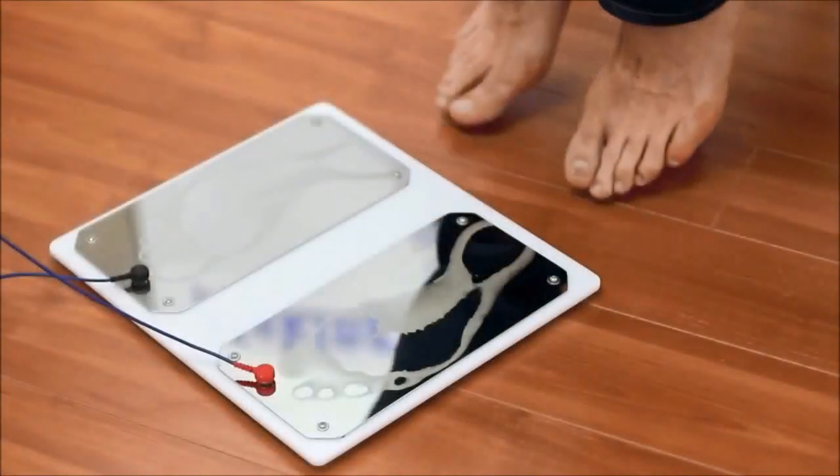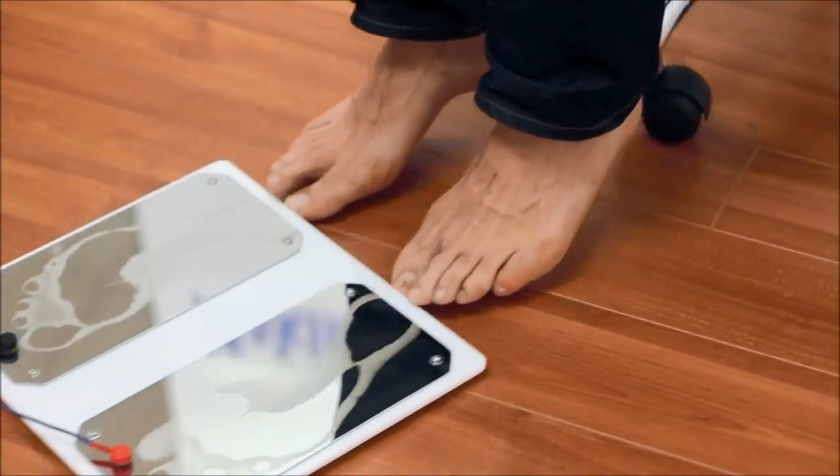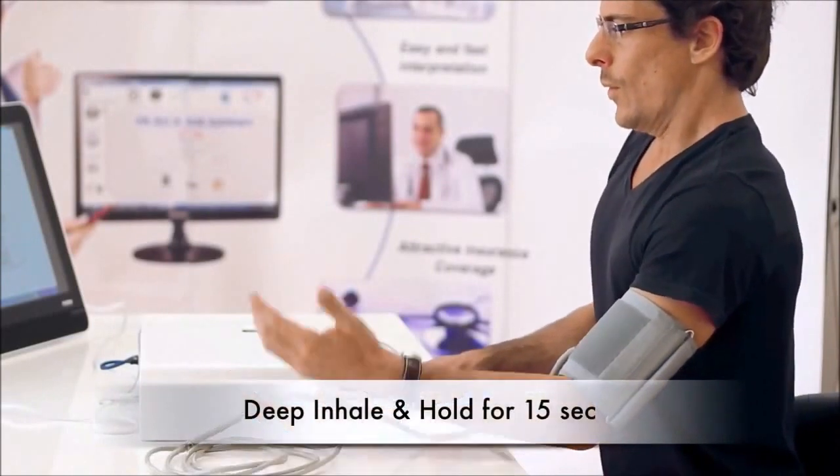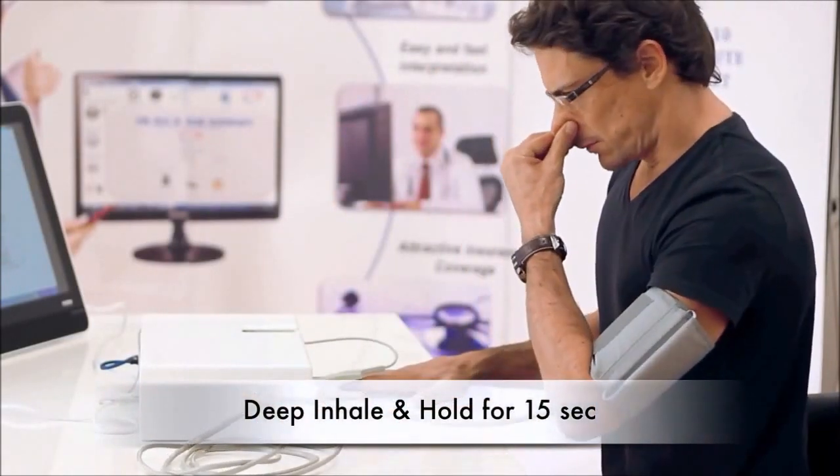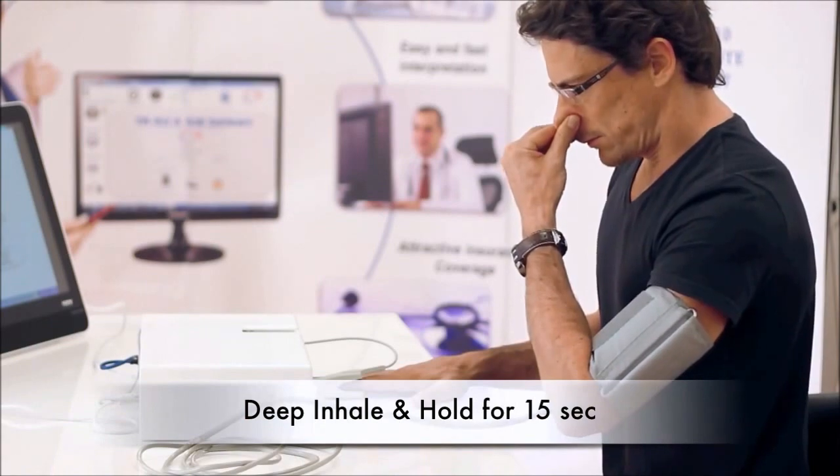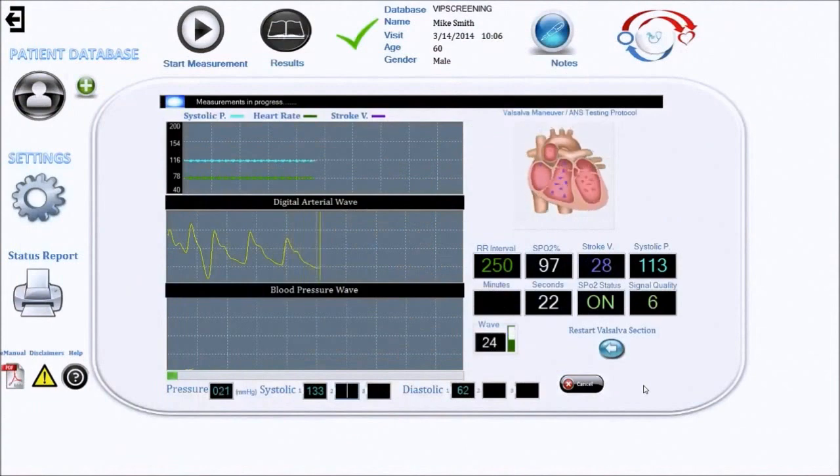Make sure to remove the footplate away from the patient. It is now time to explain to the patient how to perform the Valsalva maneuver. Once the patient is ready, click start and the patient is asked to take a deep breath. While holding it in, close the mouth, pinch the nose shut, and press out as if blowing up a balloon without releasing any air. Using a software timer, hold for 15 seconds, and then breathe out forcefully.